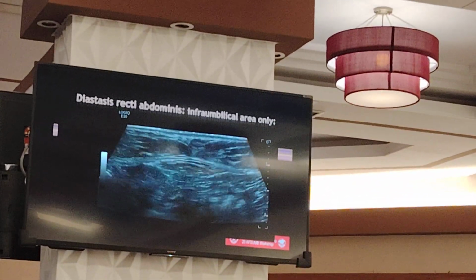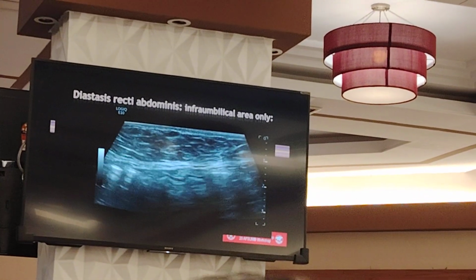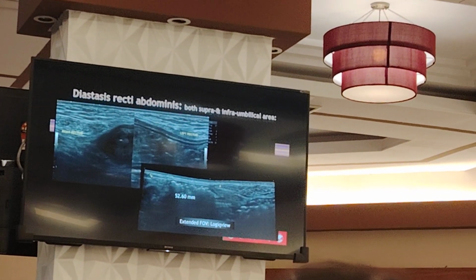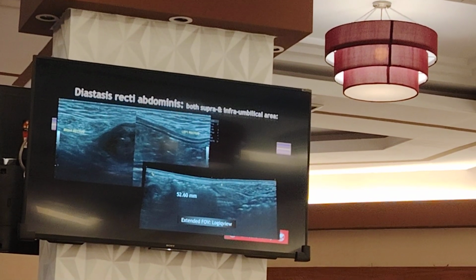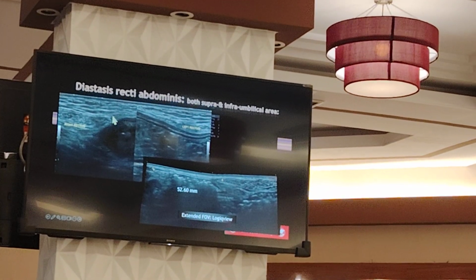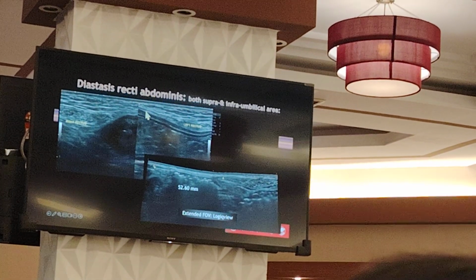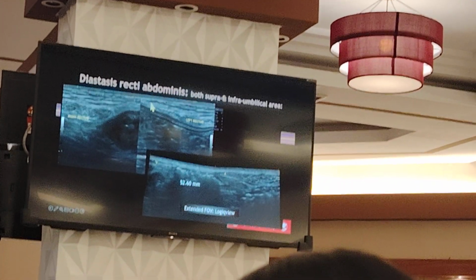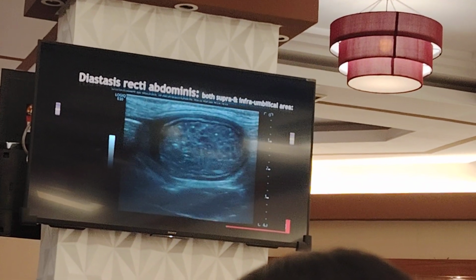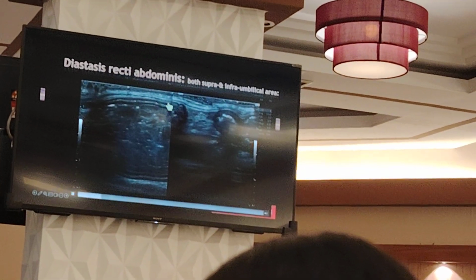And this was the size in panoramic view, 42 mm, widely apart. This is another case, diastasis recti abdominis, size approximately more than 5 cm on panoramic view. How do we appreciate? This is right rectus, this is medial edge, and we focus over here. This is left rectus abdominis, this is the tapered edge. And from here, the entire linea alba is, remember, intact in diastasis. This is a video of the same case. We will appreciate this echogenic line, this is linea alba, what is this?